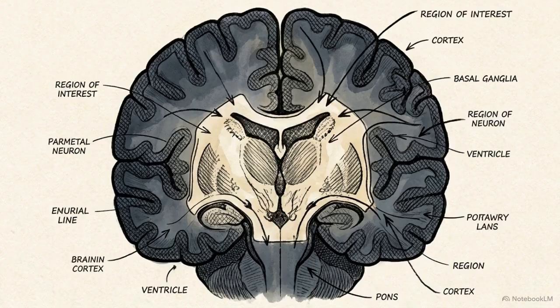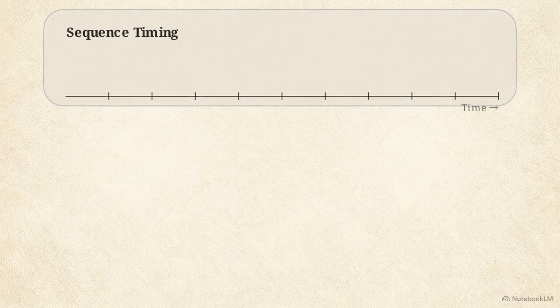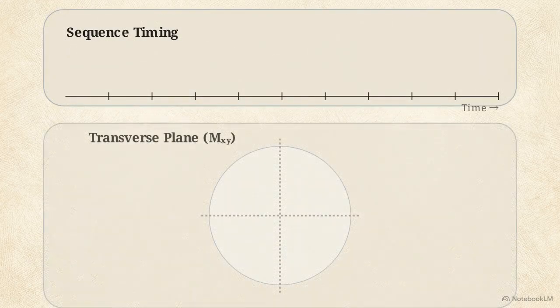The spin echo sequence does not create a new type of signal. It uses a temporal trick to recover lost amplitude, forcing the sequence to touch the true T2 curve at one specific calculable point in time. This dual pane layout correlates the sequence timing on the top with the physical movement of proton phase vectors on the bottom. Step 1 occurs at time 0 with the application of the initial 90-degree RF pulse.